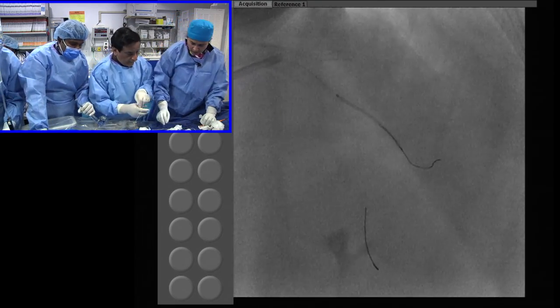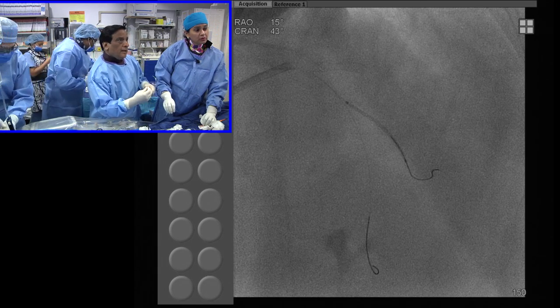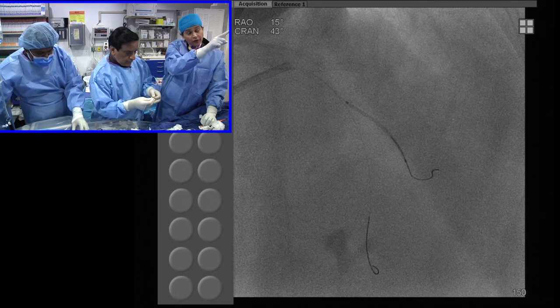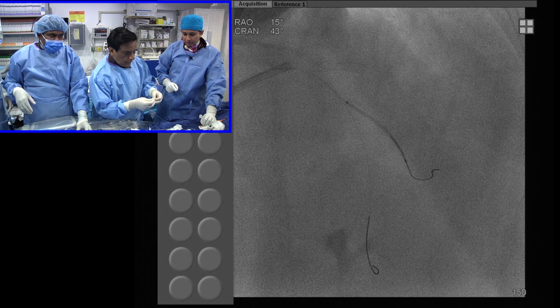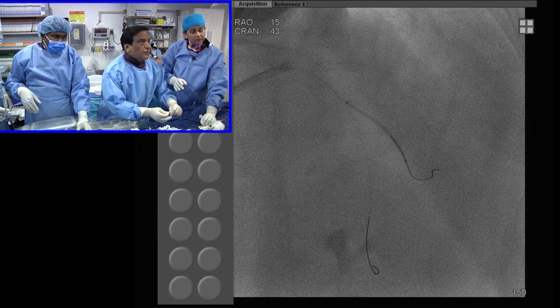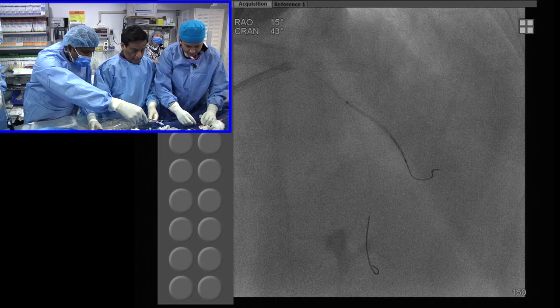This is for the main vessel. You want to change the length? Which one? This is down, okay. It's not too far distally. Okay, you want to change to 20. The side branch, the question is that 24 is too long, although see if the wire is in the main vessel, see that?